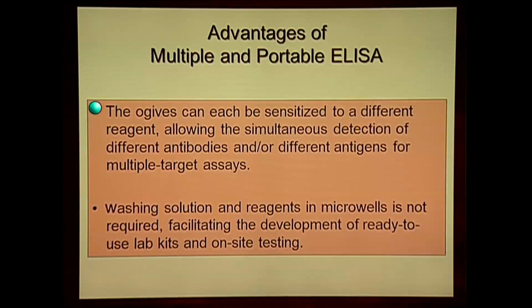The advantage of this ELISA is that each rod can separately be sensitized for different antibodies. So at a time we can perform many different experiments, and washing and then addition of reagents is very simple here, so it can be done very quickly and on the spot.